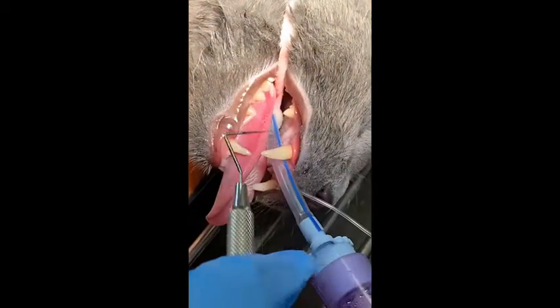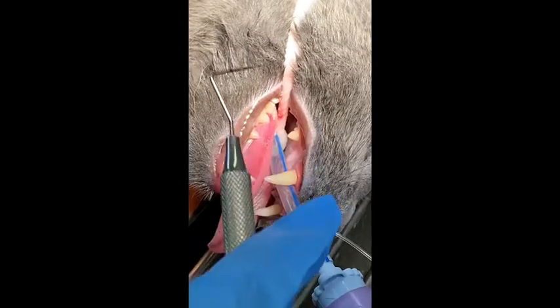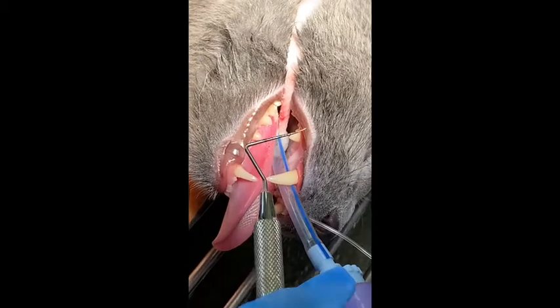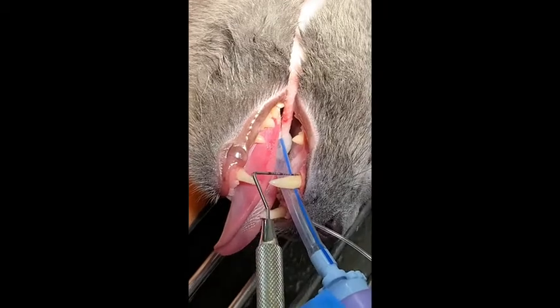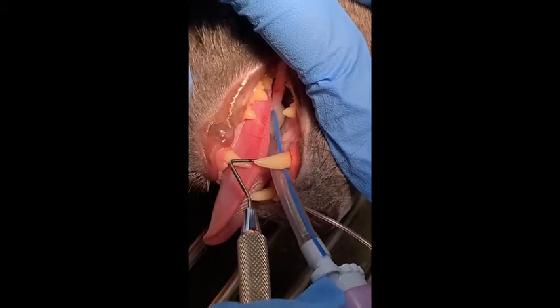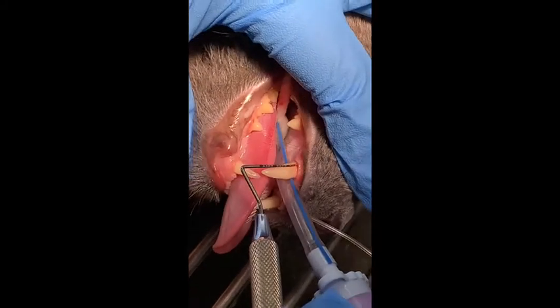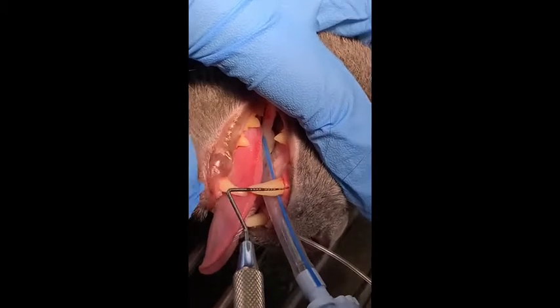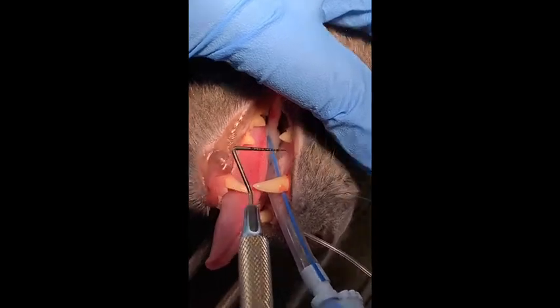Then we've got the canine here, which is 104. This does have a little bit of gingivitis, so probably a grade 2, and going around the whole circumference of the tooth, making sure that is the same depth, so I'm probably getting about a 1 going around there.